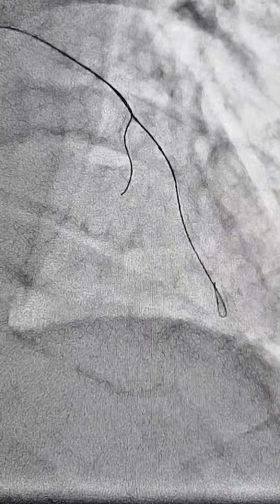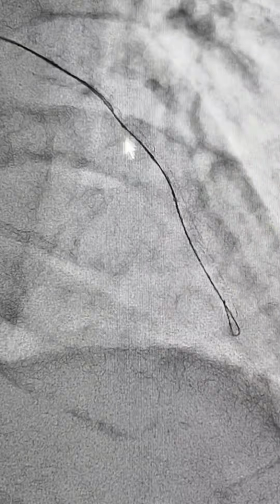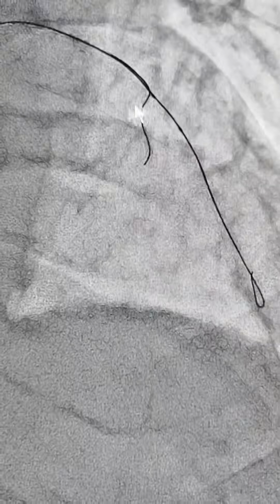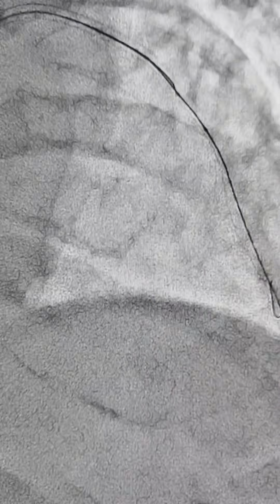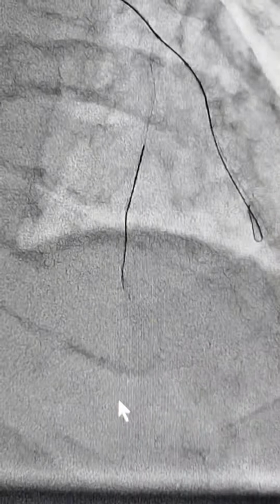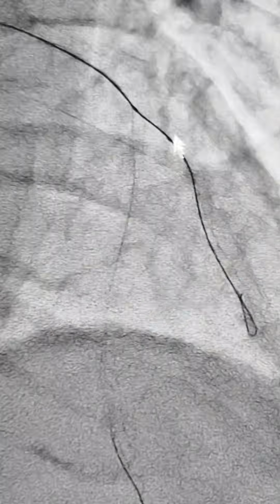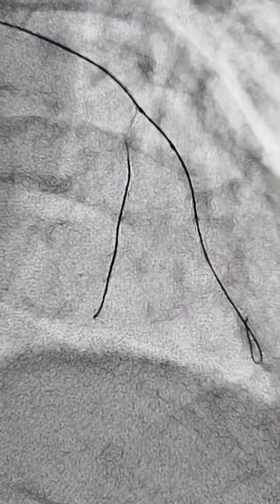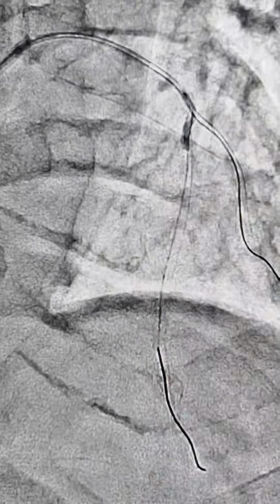So the next step is to use a Twinpass. So this is a Twinpass, and using the Twinpass, we put the proximal marker at the junction, and managed to get a workhorse wire through this area. As you can see, we managed to get this wire down here through this Twinpass catheter. It's got two markers. One marker is here, one marker is there, and we managed to get a wire in. And so this was the hard part.